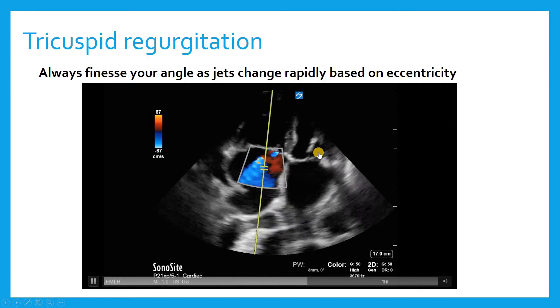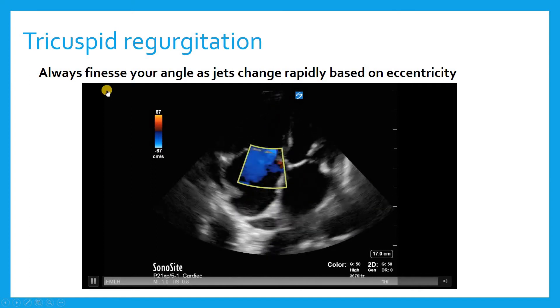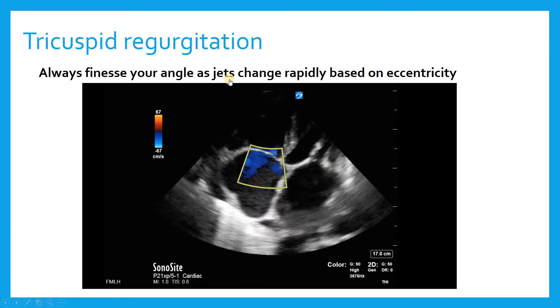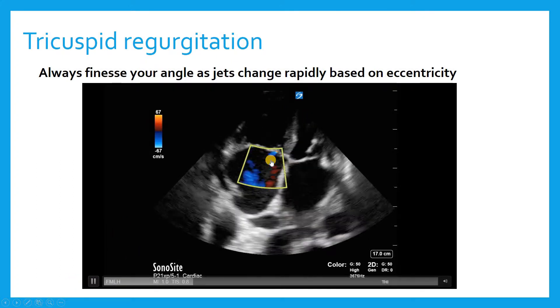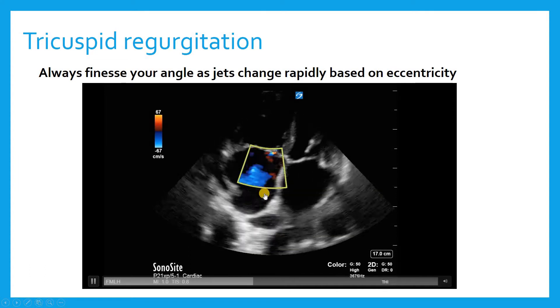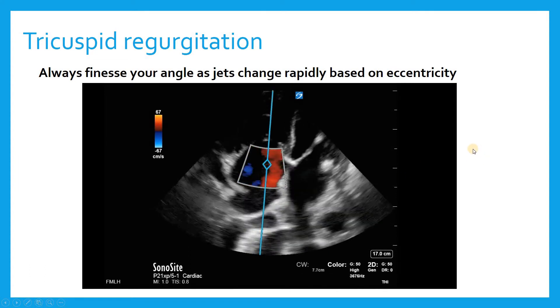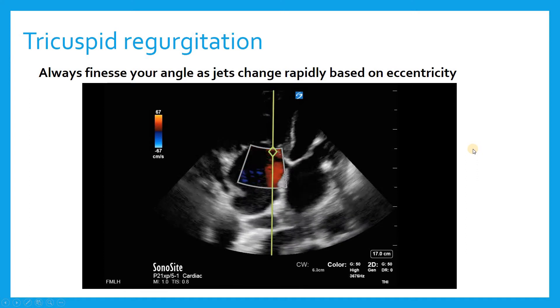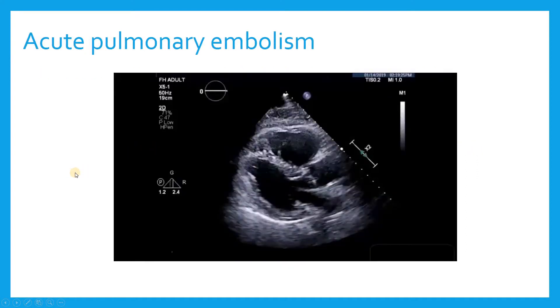From the apical four-chamber view, you really have to finesse the angle of your probe a little bit when in this view and try to get the jet to come out maximally. Depending on how you're looking at the jet, it may not look like very much — and then it may change to occupying more than half the right atrium, and you'd realize it's actually a much bigger jet than with the first view.